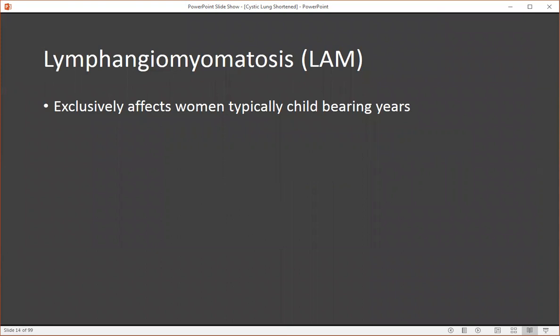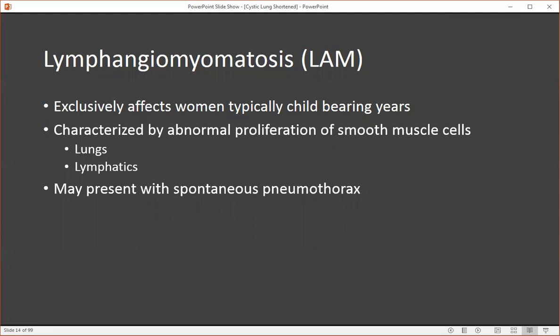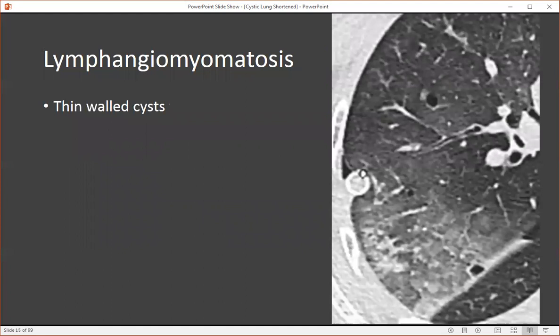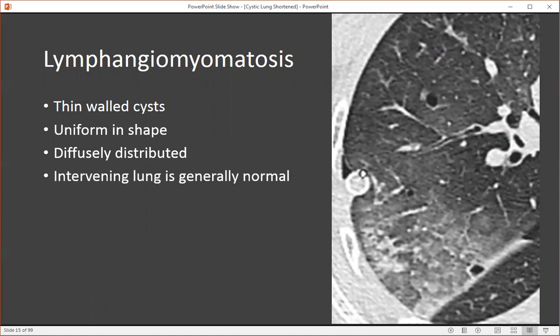Lymphangiomyomatosis exclusively affects women, typically of childbearing years. It's characterized by abnormal proliferation of smooth muscle cells adjacent to airways within the lung parenchyma and lymphatics. These people may present with spontaneous pneumothoraces, and ultimately this is a progressive disease with a poor prognosis. The treatment is lung transplant. On CT, we see thin-walled cysts that are regular and uniform in shape, diffusely distributed throughout the lung parenchyma, and the intervening lung is generally normal, the exception in this case being re-expansion pulmonary edema.